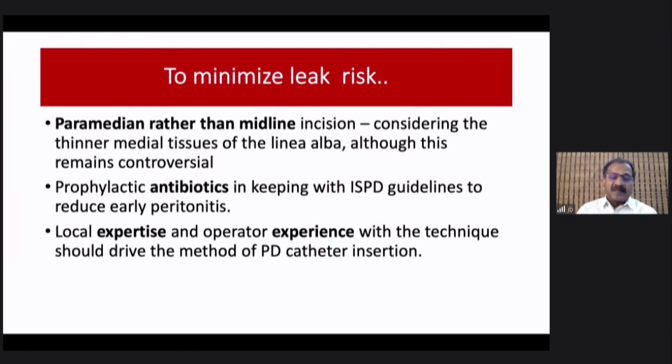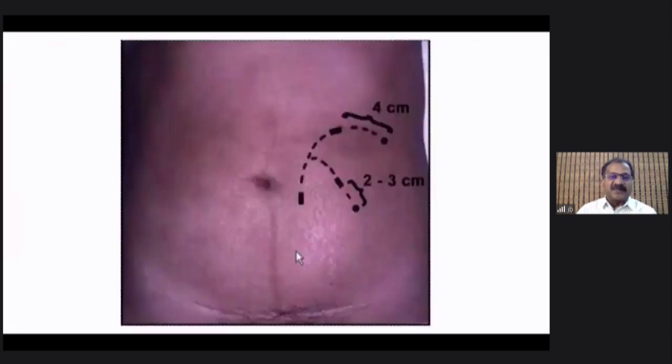And also the method and how you approach and how you bring out the catheter, tunneling, etc. It all would depend on the local expertise and the preference of the operator who is there. So we can't impose something which he is not familiar with. So that should be the driving force behind the selection of the method and the catheter.